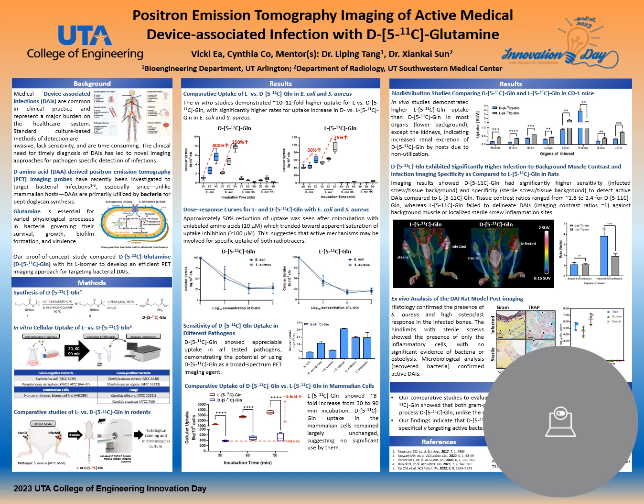To begin, we first wanted to establish a baseline for L-glutamine versus D-glutamine in bacteria. To do this, we chose the bacteria E. coli and Staphylococcus aureus, which represent more commonly found gram-negative and gram-positive bacteria associated with device infections. The probe was synthesized with a carbon-11 as the radiotracer, then incubated with cells for 30, 60, and 90 minutes.